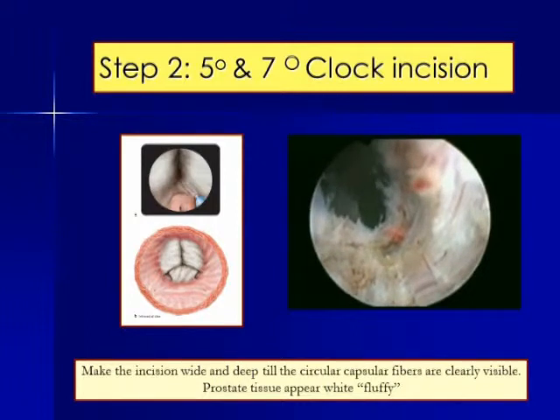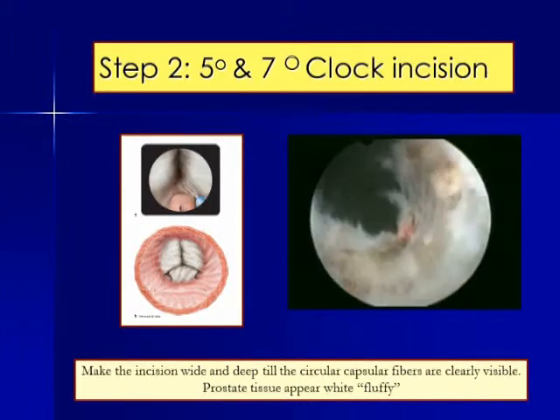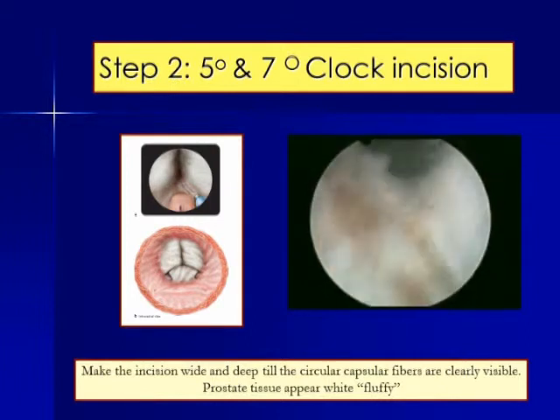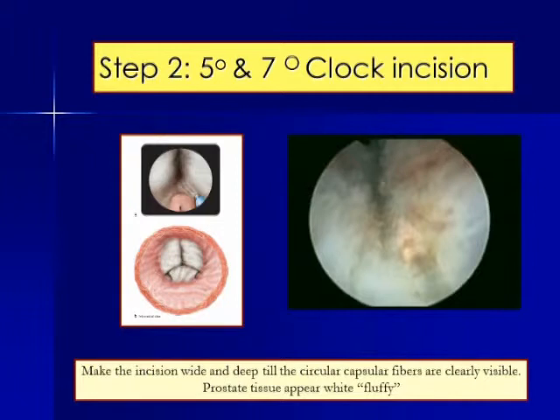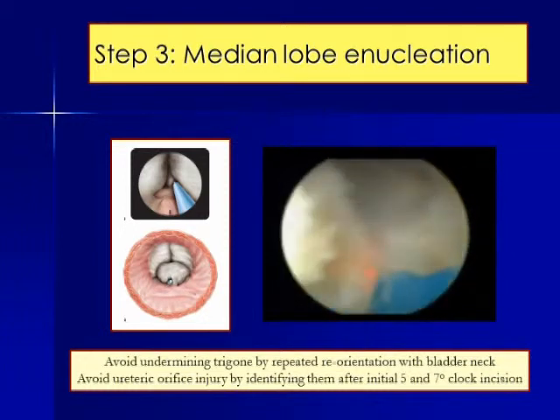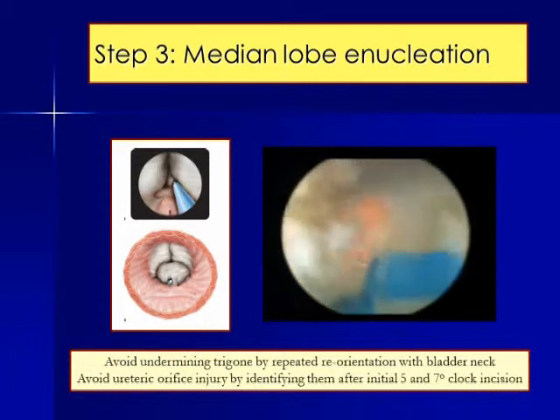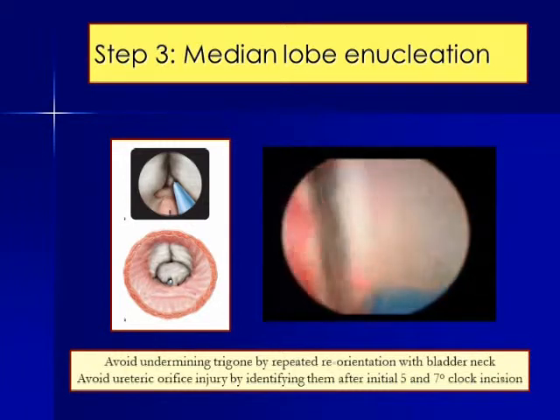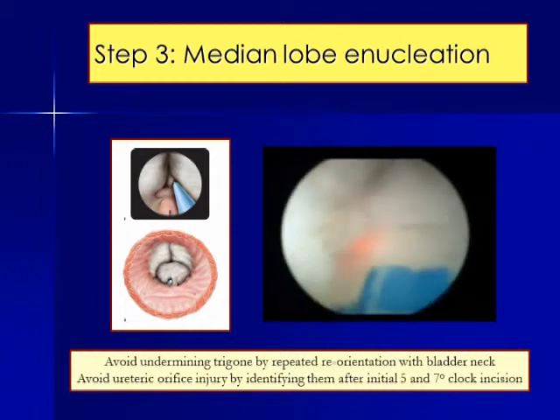Here we can see the bladder neck, which is already seen there. And once we make an incision, it is important to deepen and widen it on both the sides so as to have a good trench. And this makes the further enucleation simpler. Once the 5 and 7 o'clock incisions are taken, they are joined in front of verumontanum, and then the median lobe is lifted with the help of a resectoscope beak, and then we undermine this lobe staying on the capsule and push the lobe in the bladder.